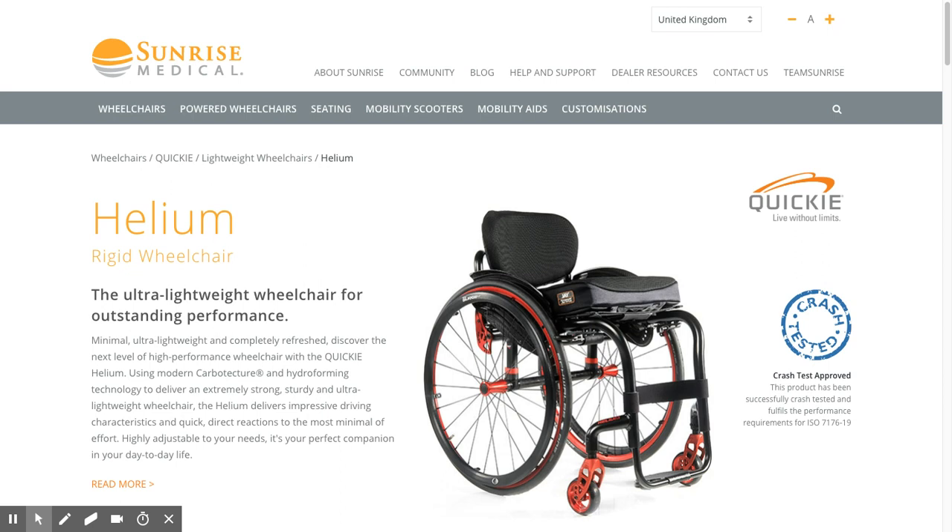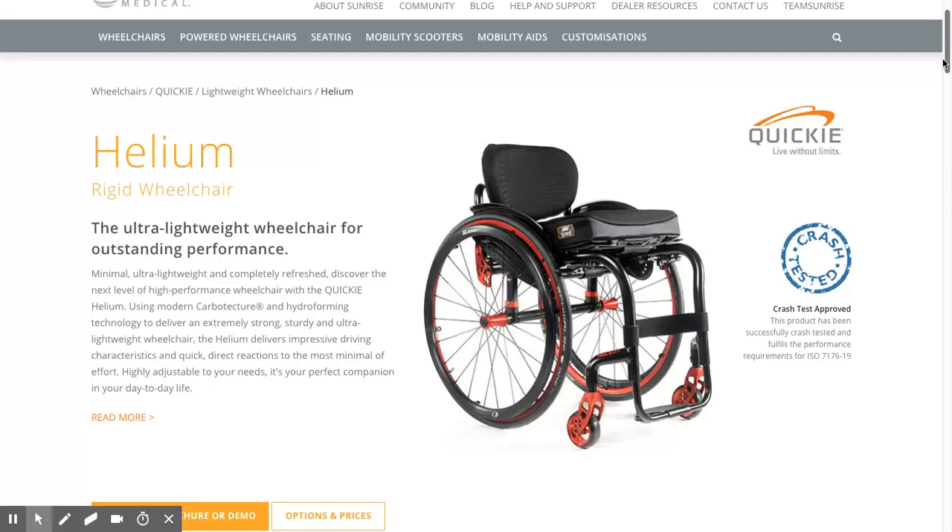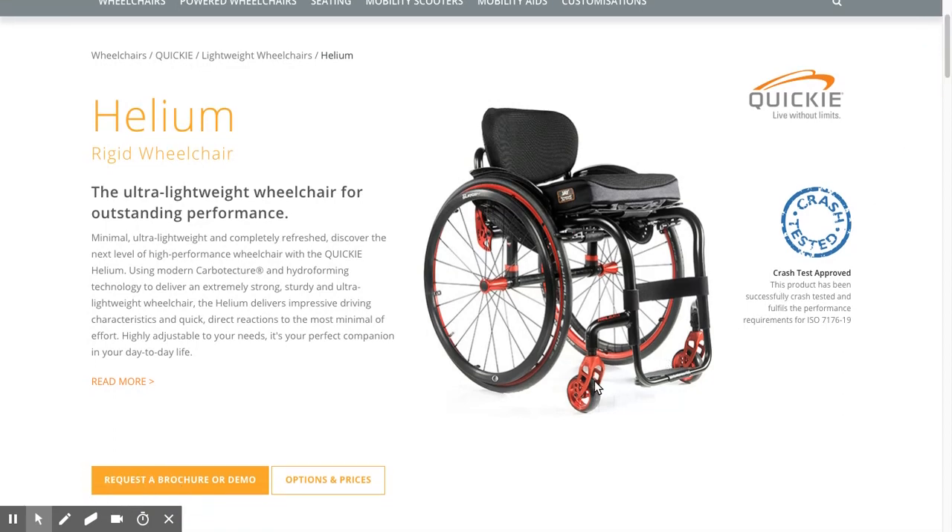Hi, it's Scott from Invictus Active. We're looking at the Helium rigid wheelchair and whether it's going to be compatible with a freewheel attachment. The answer is yes, you can fit a freewheel attachment to a Quickie Helium, but there are numerous different types of footrest that the Quickie Helium can come with.